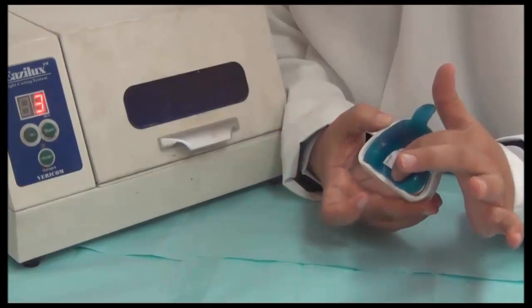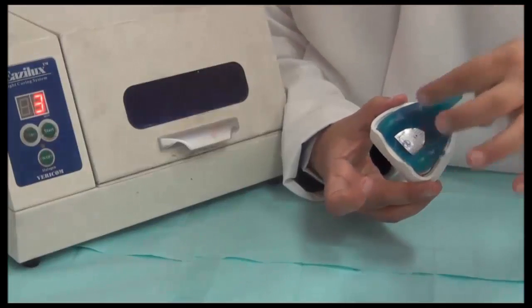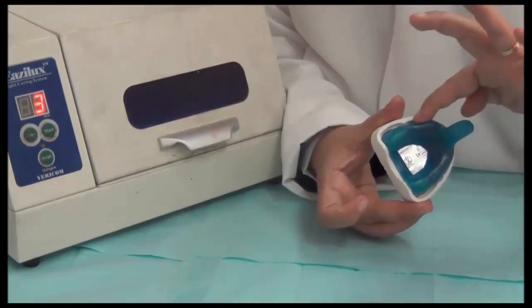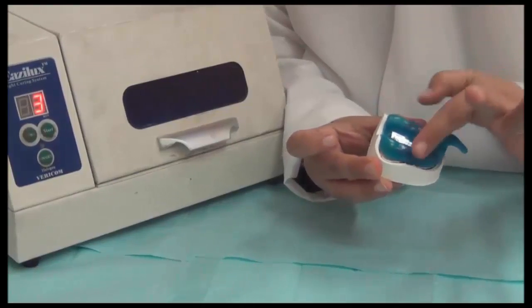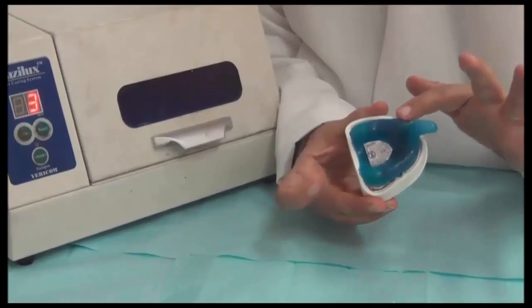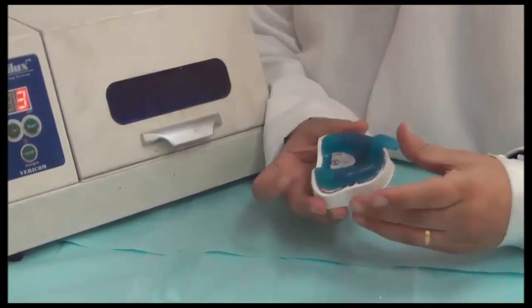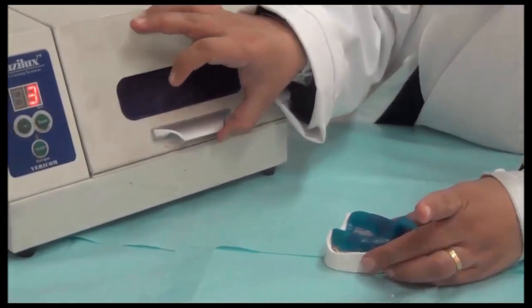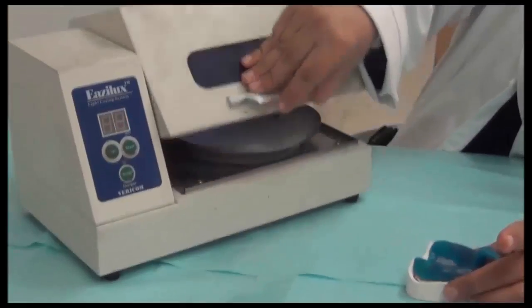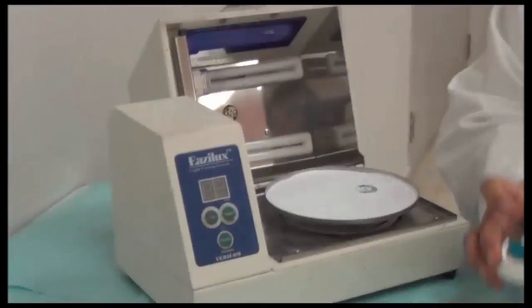And we have here the opaque layer. This will reduce the shrinkage in the palatal area, and it is fully adapted from all sides. We also make sure that there are no projections inside the sulcus outline, because it's easier to remove them when it's soft acrylic than in the final material.